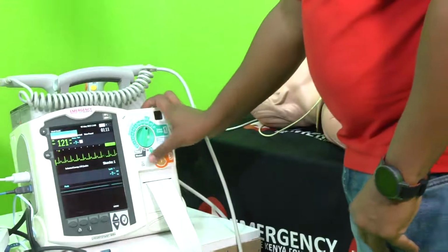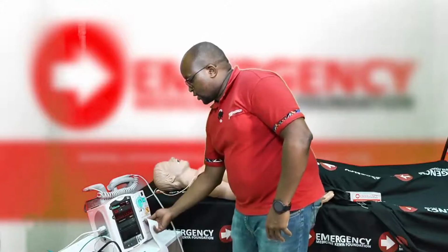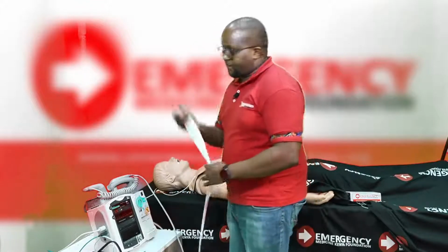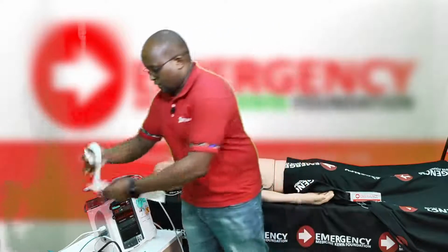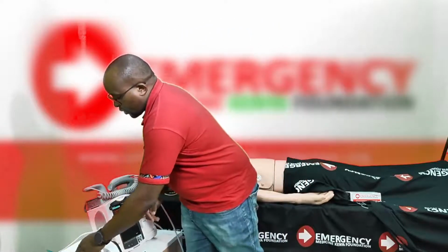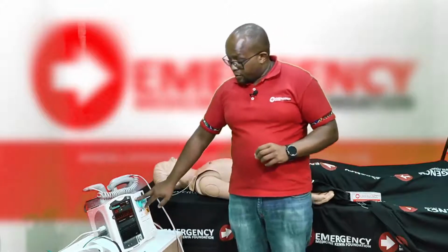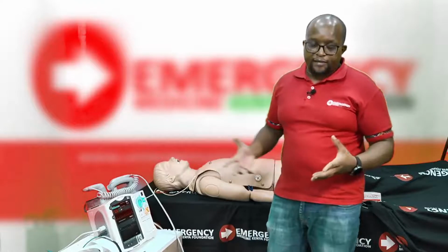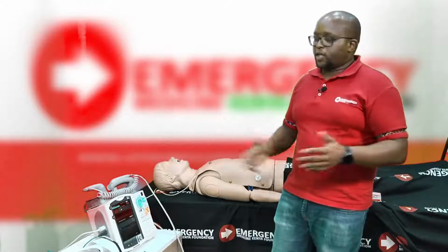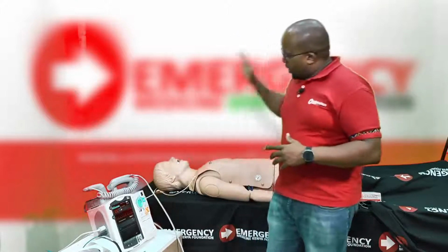All right, and we have a cool tracing on that. Okay, so just some key factors that we need to discuss in terms of synchronized cardioversion. As I mentioned, the first thing you want to do is make sure you press the sync button. So the indications, of course, is a patient with a very fast heart rate, above 150 for adults, above 180 for kids. So very fast heart rate, okay?